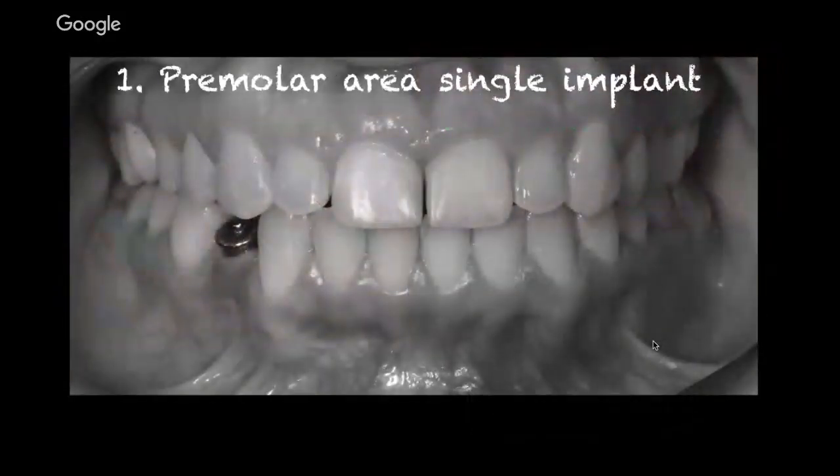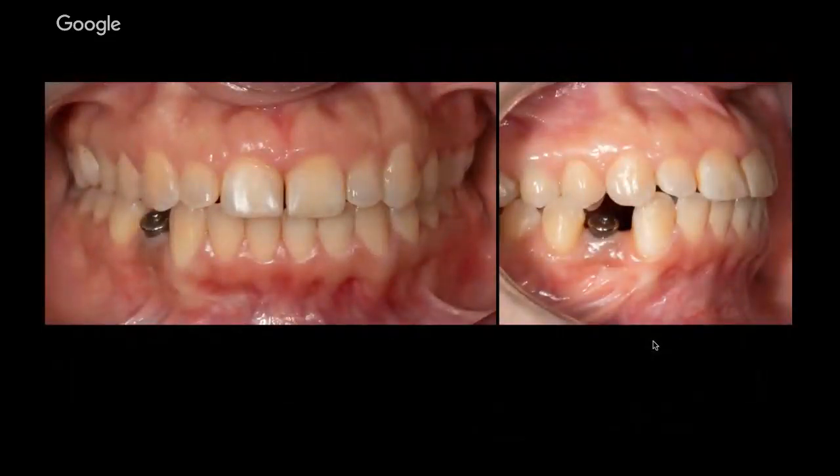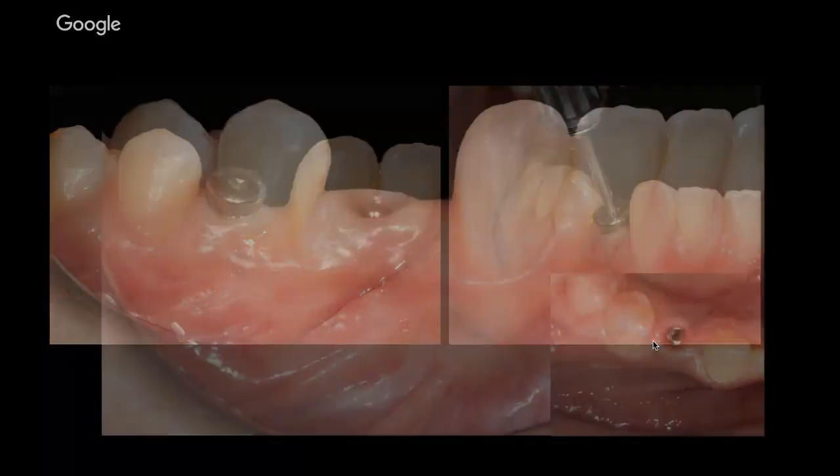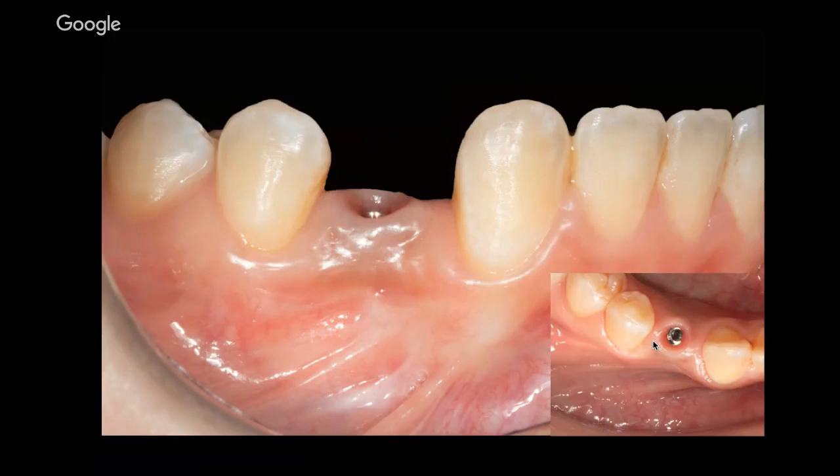Let's see the same mistake in the aesthetic zone. She's a young lady. In this picture, it may seem that our biggest problem is the angle, but research has shown us that the angle has no negative role in preserving the margin of the bone. This patient also has a similar vertical problem. In my point of view, the surgeon misunderstood the 3 millimeter rule, and applied the 3 millimeter rule inversely. Please look.